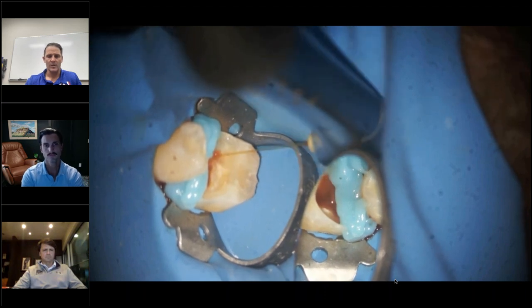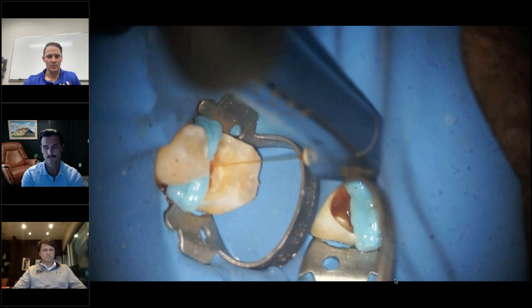And then as I go in the MB canal here, you're going to see a little heme come out of it first. There was a little resorptive defect in there. So you're going to see some heme coming out for the first time. We're going to flush that out. And then notice the difference when we go back in. Just a second. So I'm going in the mesiolingual, activating.